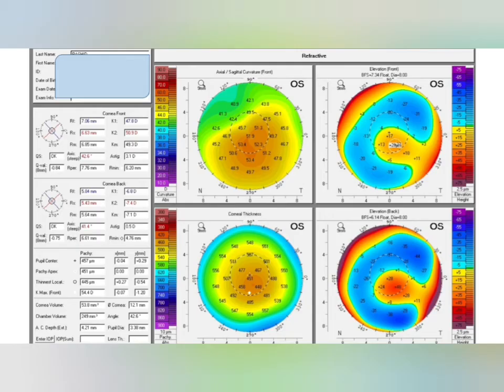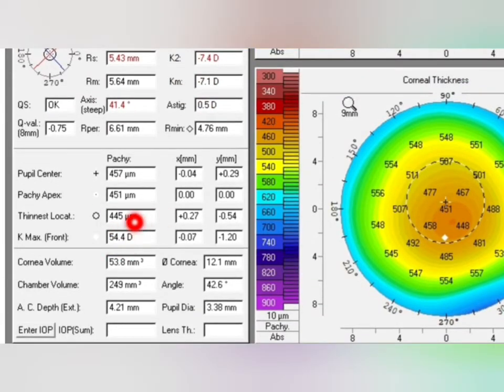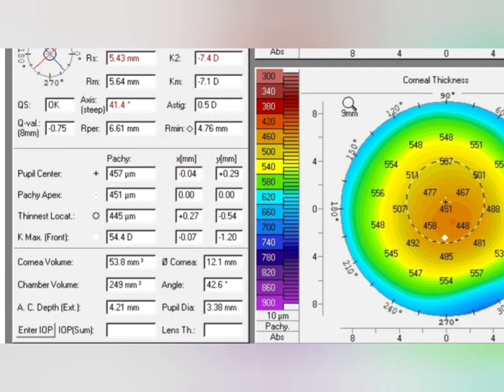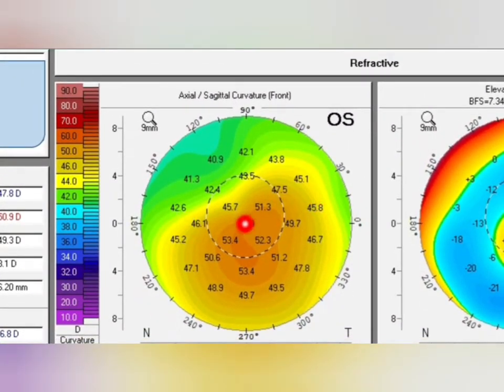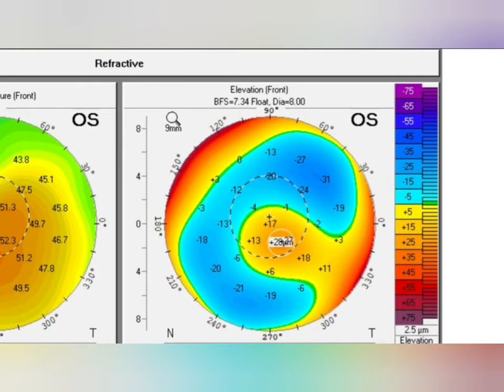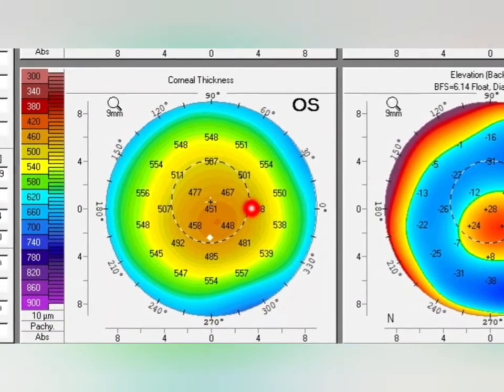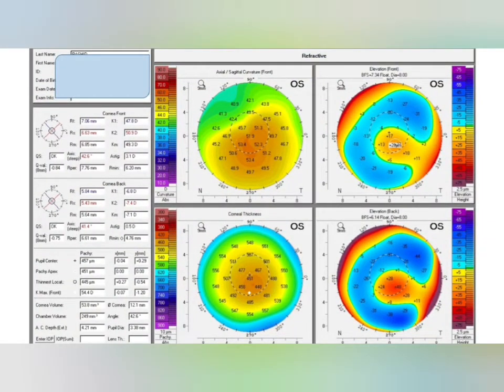Next case: Q value is normal. The Kmx value is 54.40 diopters — it should be less than 47.20 — indicating more steepness. Y-axis deviation is more than 0.5 and the thinnest local is 445. From these values, we understand the cornea is abnormal. The anterior sagittal map shows inferior steepening, and the difference between the two opposite corresponding points — 51.20 and 42.4 — is more than 2.5, strongly indicating corneal ectasia. In elevation front it is plus 17, more than plus 8, indicating an ectatic condition.